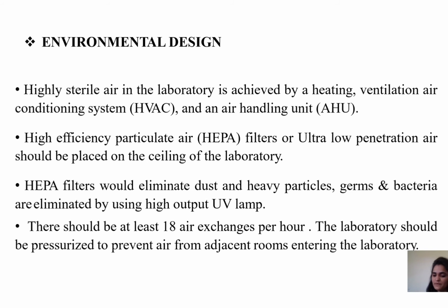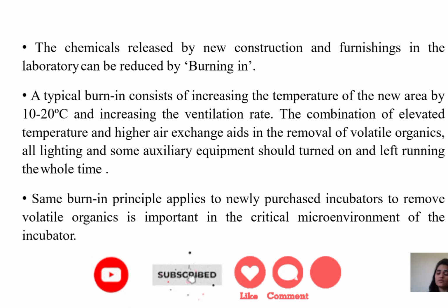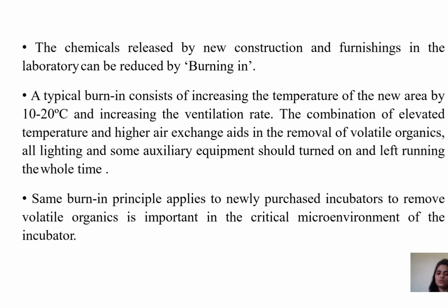The laboratory should be pressurized to prevent air from adjacent rooms entering the laboratory. The chemicals released by new constructions and furnishing in the laboratory can be reduced by burning in. A typical burn-in consists of increasing the temperature of the new area by 10 to 20 degrees Celsius and increasing the ventilation rate. The combination of elevated temperature and higher air exchange aids in the removal of volatile organics. All lighting and some auxiliary equipment should be turned on and left running the whole time.